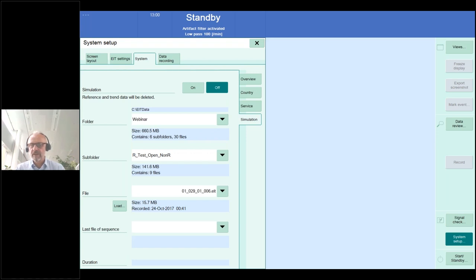So whenever you see the presence of lung collapse, basically no ventilation taking place in the dorsal region, and then you automatically have this transition zone, and if you take a look at the local waveforms and see there's a presence of late opening, early closing, all these kinds of indicators suggest cycling opening and closing. And then, of course, in order to avoid this condition, the clinical users would probably increase the PEEP settings by steps of two until they see the absence of cycling opening and closing.